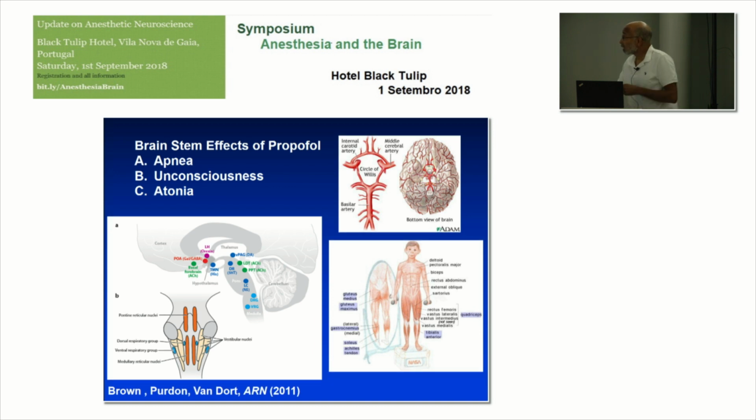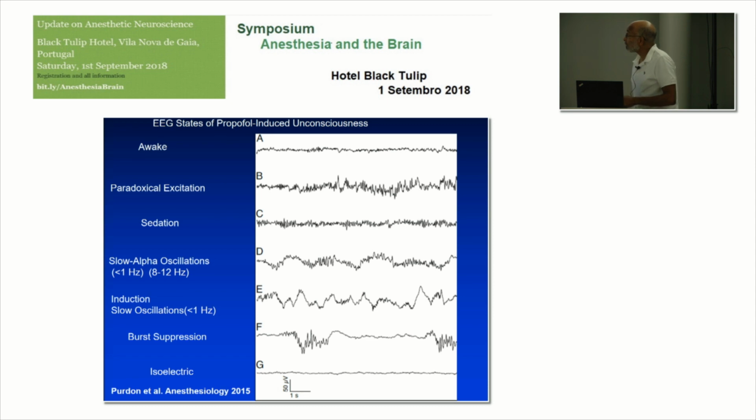There's more that I could say about the atonia, but I'll skip that for the moment. So these are the states that we saw this lady go through. She was awake. Then she went to the sedative state, which was the beta oscillations. Then we saw her jump way down to these large, slow oscillations. She was in burst suppression. The period between the bursts, she's isoelectric.